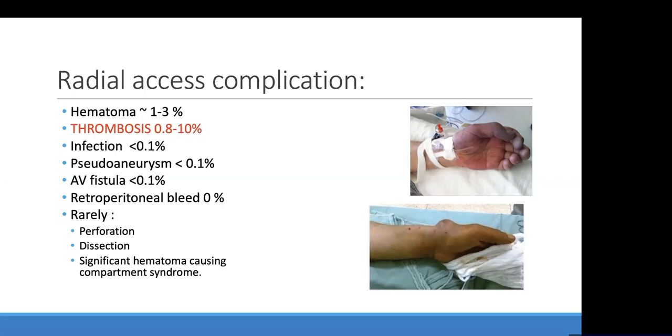Because it's been shown that when you do perforate at the beginning, where the wire is distal, and then carry on with your procedure, at the end of the procedure, when they do a control angio, the perforation is gone. As I told you, the radial is our friend and it seals. That seals by the tension of the sheath, which is just putting an outward tamponading effect and preventing the perforation from staying.